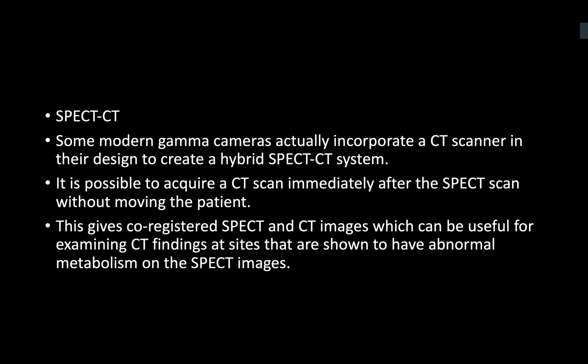It is very useful in prostate cancer to make sure that we are not misdiagnosing an old fracture or old vertebral lesion, like a vertebral collapse or any vertebral fracture, as a tracer uptake, which may be misdiagnosed as a metastasis. Okay, well done.